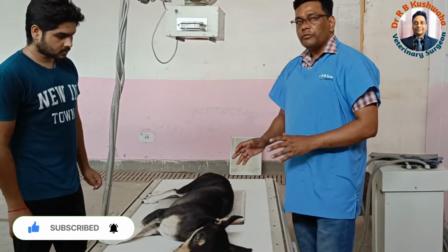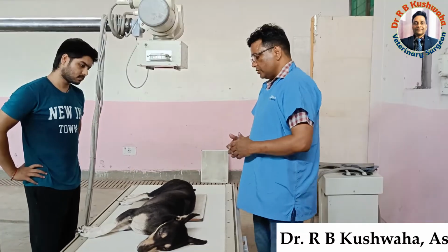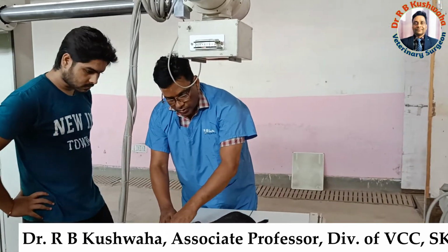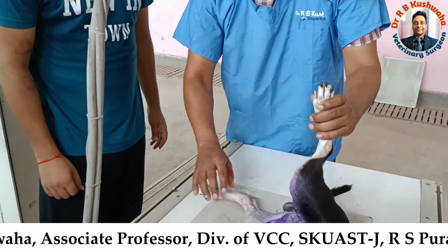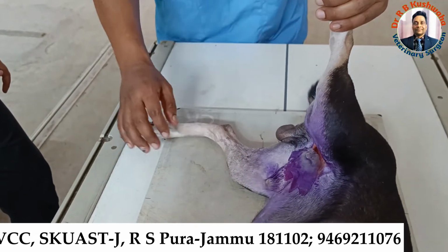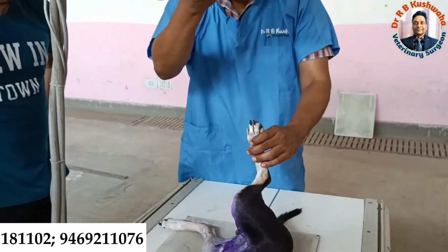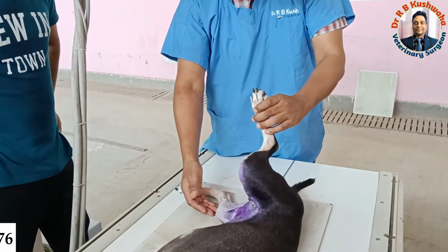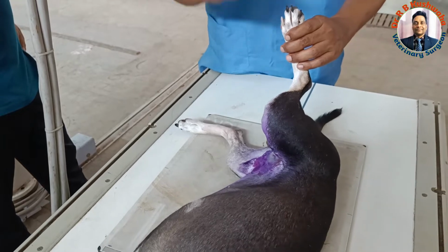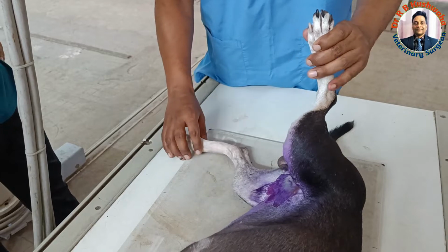So in this video I am going to demonstrate how to develop a radiograph by the CR system. For the exposure of the femur bone, this is the mediolateral view. This is the medial part of the thigh and this is the lateral part of the thigh. Mediolateral view means the medial part should face the X-ray beam, whereas the lateral part is towards the cassette. In other words, the X-ray beam should enter from the medial side and exit from the lateral side.